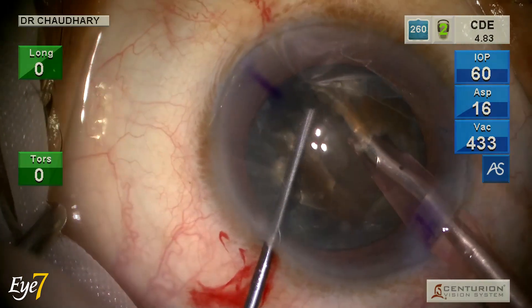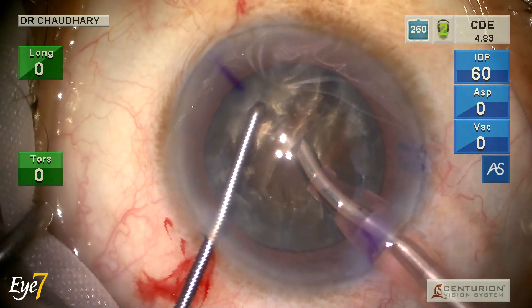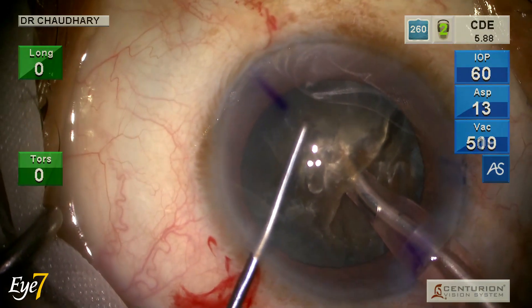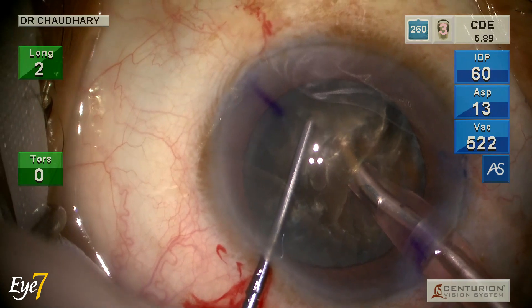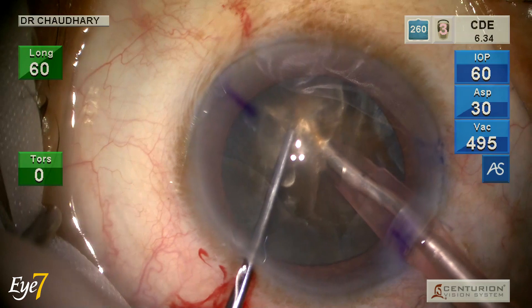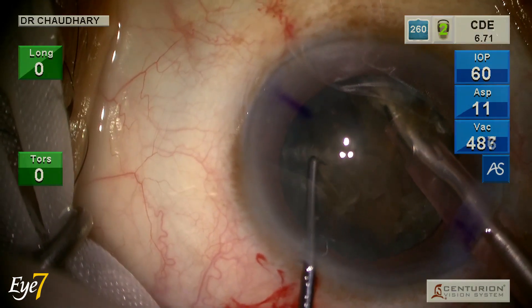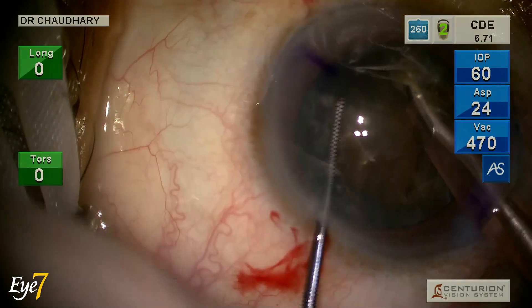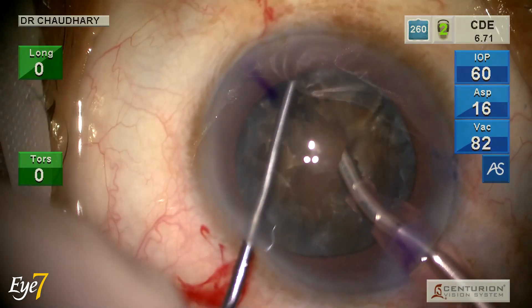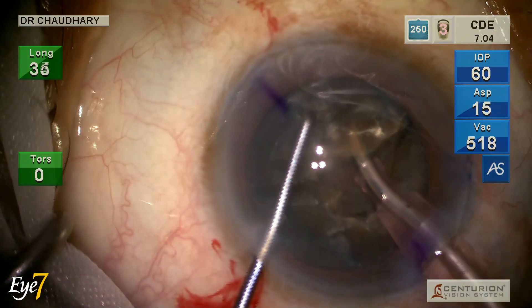I pull the chopper towards the phaco tip and the separation forces make a clean cut. Notice how the 1.6 mm long chopper sinks into the substance of the nucleus, is drawn towards the phaco tip, and the separation forces make a clear cut in this hard nucleus.